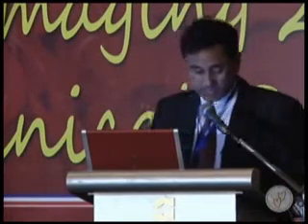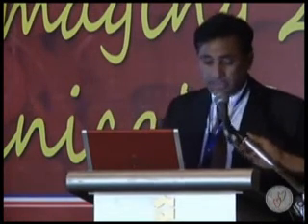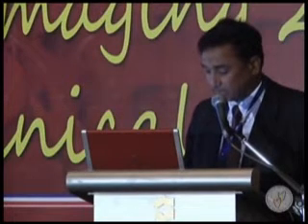It can be 2D TEE, much better than MRI or CT angio, which are also very popular, but they're not very practical. So sometimes in emergent conditions of injured patients, very sick patients, it's very important to perform TEE so that we can make a diagnosis very promptly and treat it so fast, so that way we can save the patient's life.